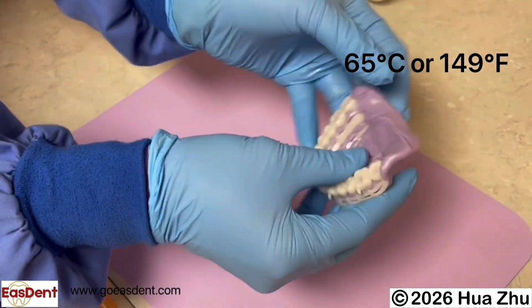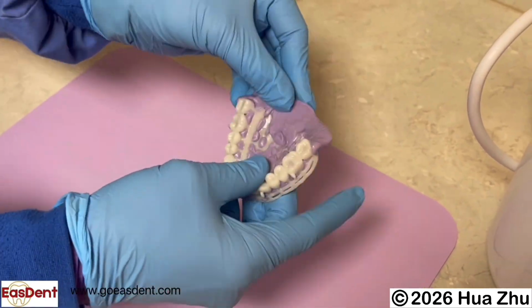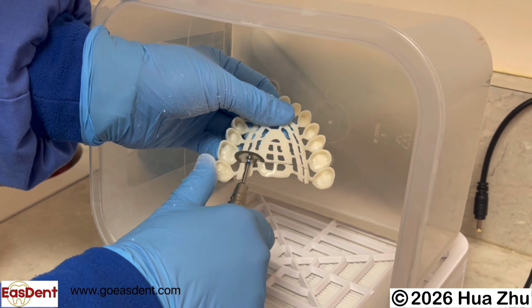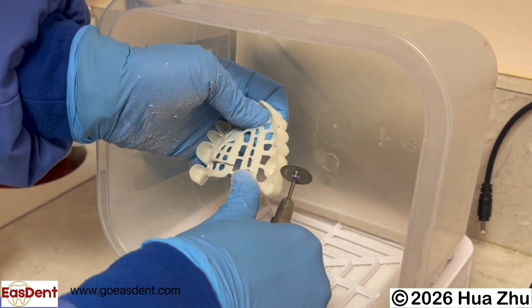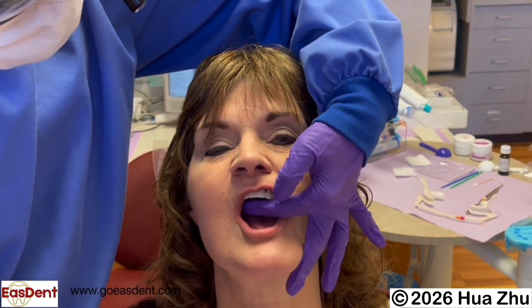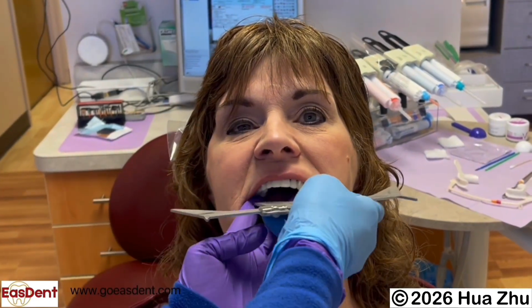If the trays are too short for the arches, you can add extra moldable material in the back. The trays can also be cut shorter to match the arches. Try the maxillary tray in the mouth to make sure the teeth can be moved to the correct position without pushing hard on the tissue.